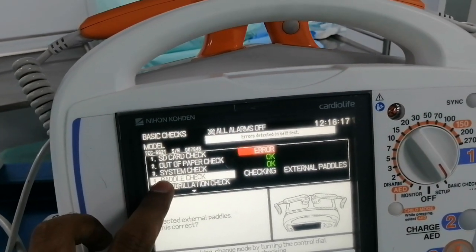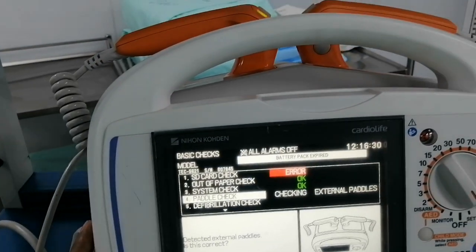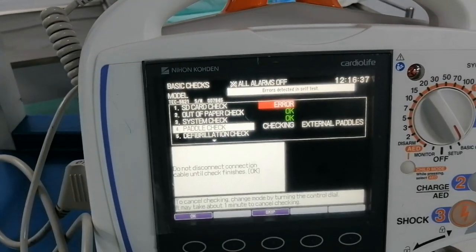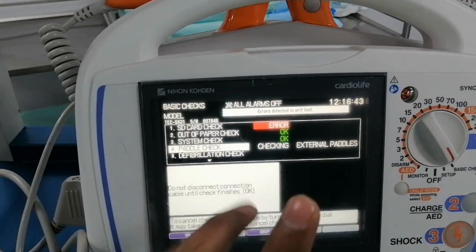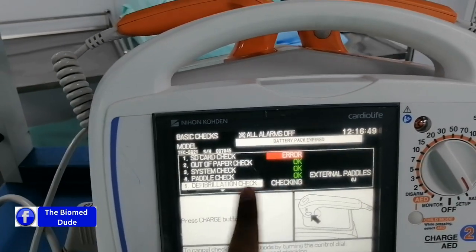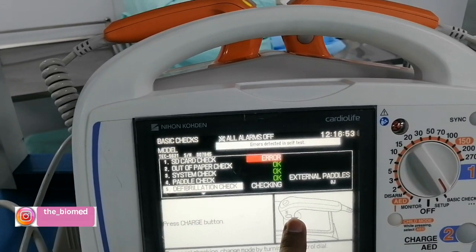Next is the paper check — by pressing the next button the paper comes out, confirming the paper is functional. Next is checking the paddles. The display shows the paddle is connected to the defibrillator, so I press yes — the paddle is okay. It checks: do not disconnect the connection cable until the check is finished, so I wait to confirm the paddle connection.